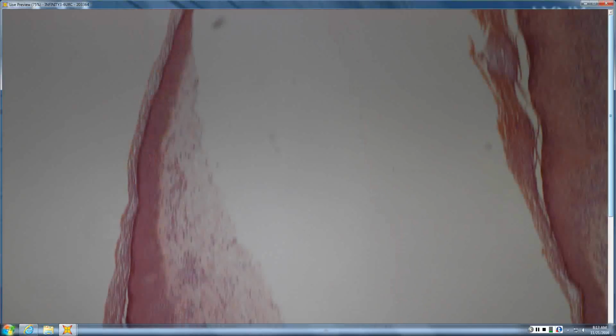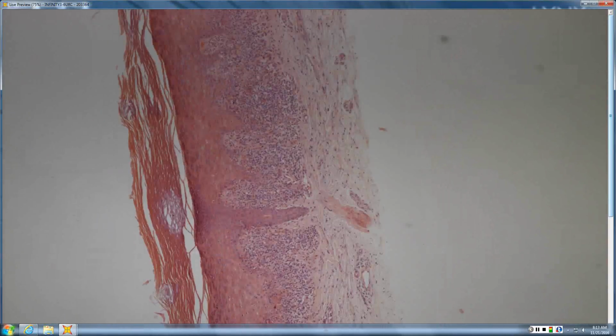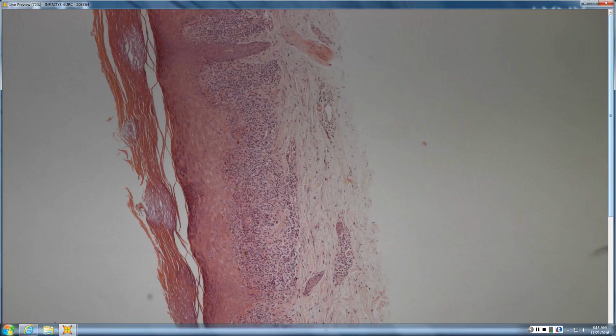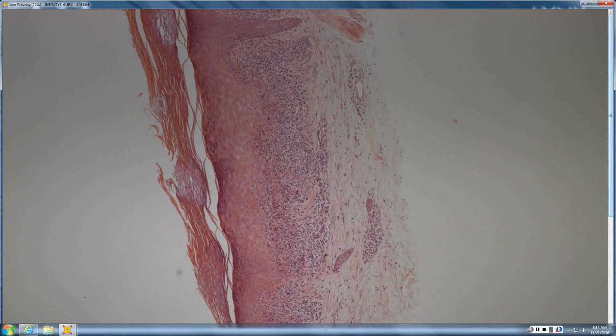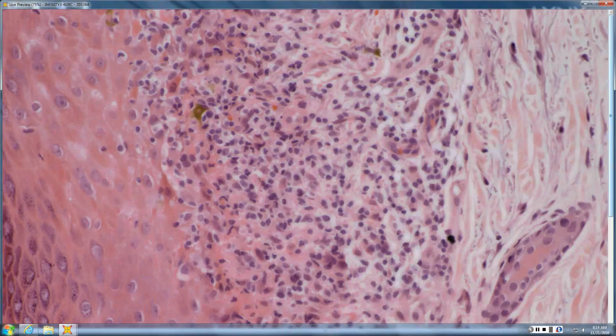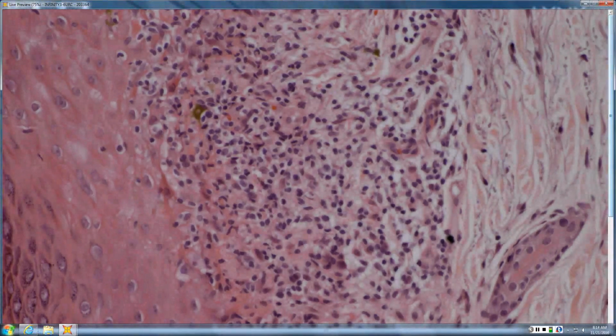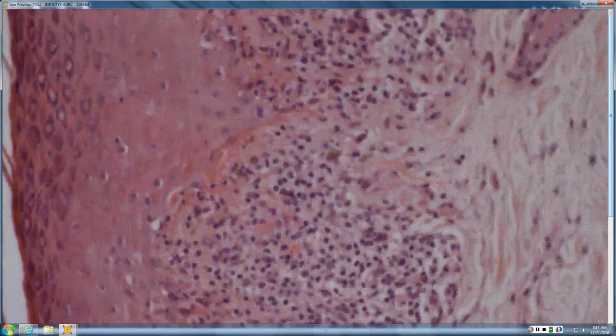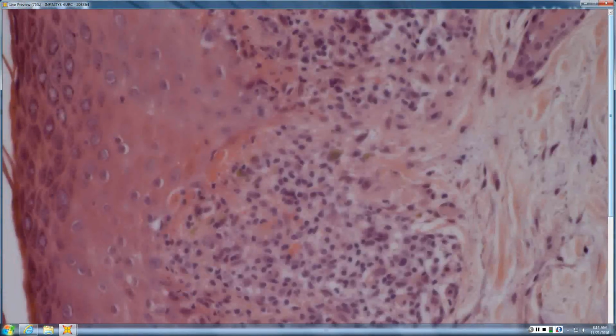Okay, how about this one? This one I was kind of unsure of. I thought that it was kind of like syphilis. It was kind of like lichen, but I wasn't sure if those were actual sawtooth or they were really slim. Yeah, so the sawtooth question is, syphilis would rarely give you dead reds, would rarely give you civatte bodies. It can happen, but it would be rare. Syphilis is the great imitator. Is it ever wrong to think of syphilis?